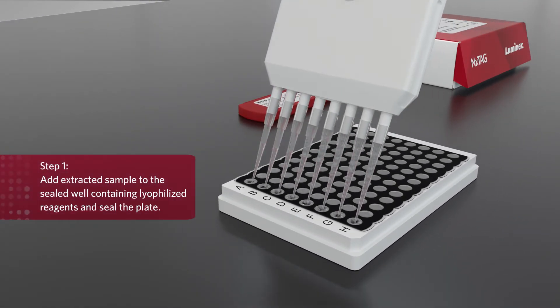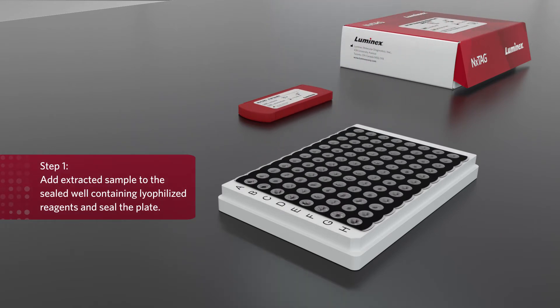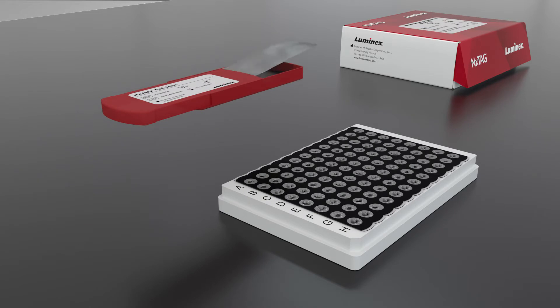Step 1. Simply add the extracted sample to the pre-sealed well containing the lyophilized reagents, and seal the reaction for PCR with the provided foil.